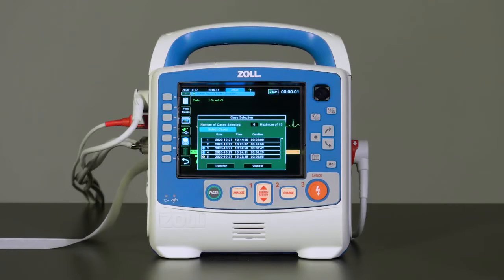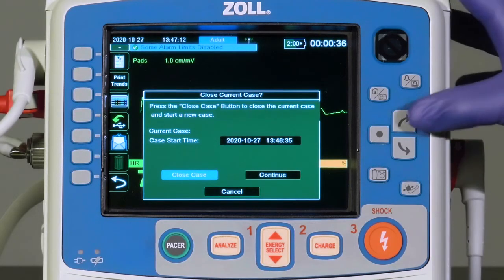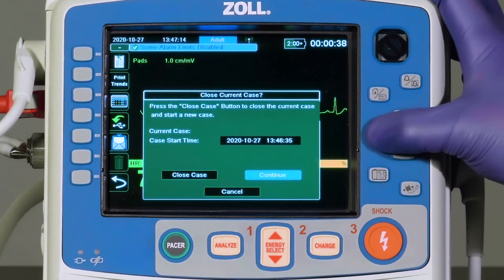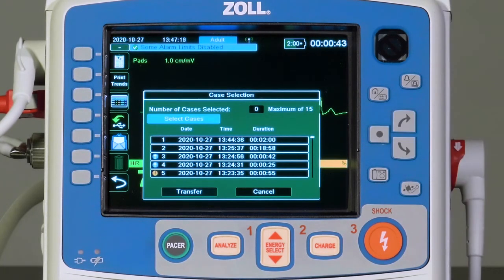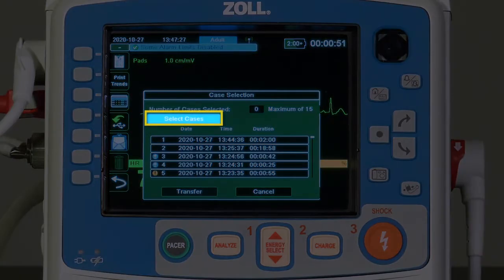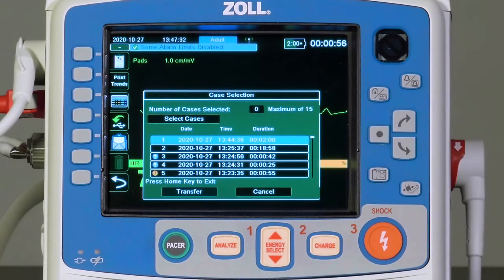When selected, the current case is completed and stored in the memory of the device. Alternatively, you can select Continue — the current case will not be closed, but allows other cases on the device to be selected. When the Select Cases key is pressed, up to 15 cases can be transferred to Zoll Online at the same time.